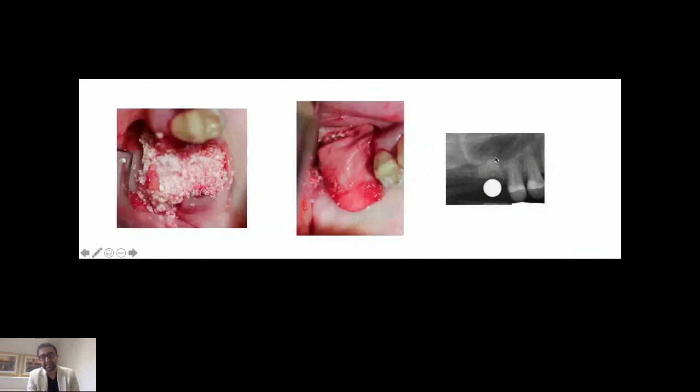And that is the post-op x-ray. You can see we've got decent bone in the area where we have taken the tooth out. So the key was that I didn't lose that bone. If I would have lost that bone, there was no way this patient would avoid a massive lateral window and graft later. But since we saw the tooth with the patient, with the tooth in, we took the tooth out and dealt with it there and then. So nice, decent bone.